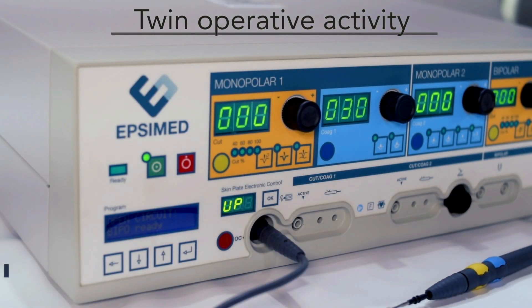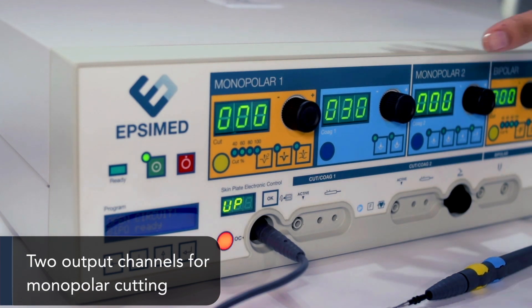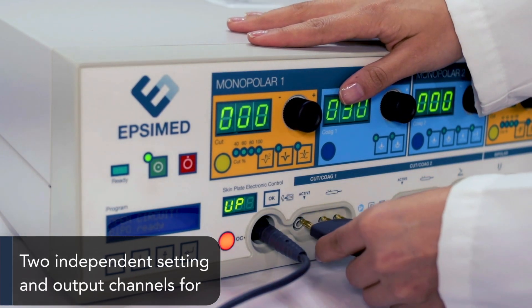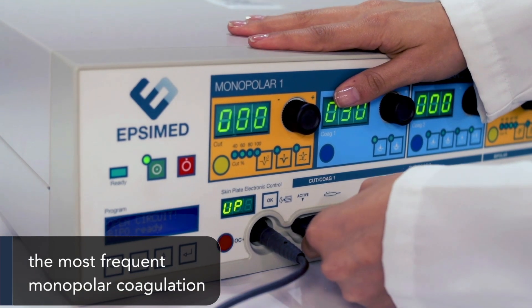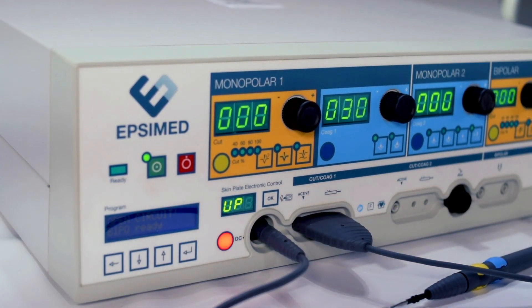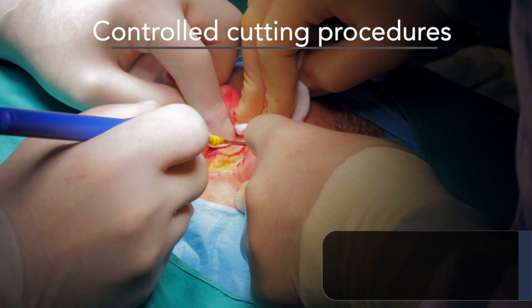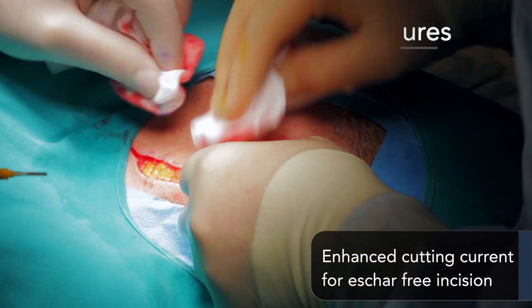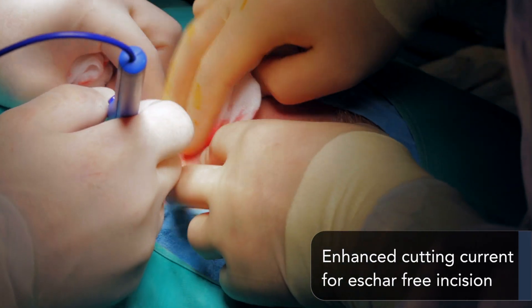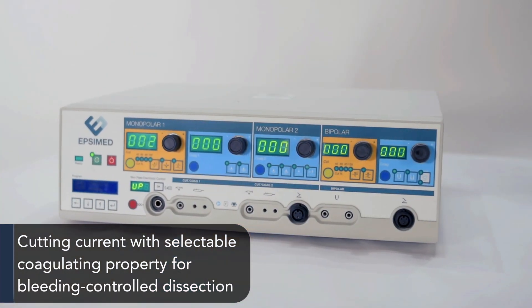Twin operative activity allows two output channels for monopolar cutting, with two independent settings and output channels for the most frequent monopolar coagulation control cutting procedures, such as enhanced cutting current for eschar-free incision and cutting current with selectable coagulation property.